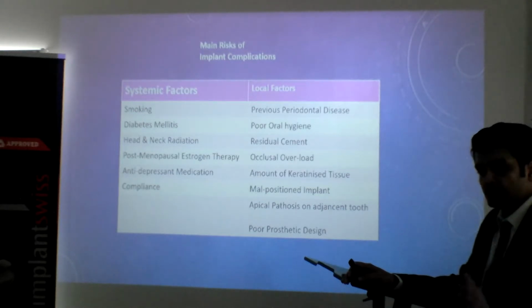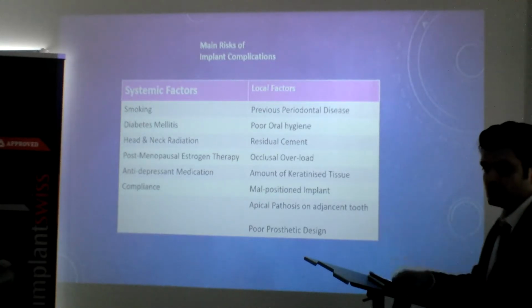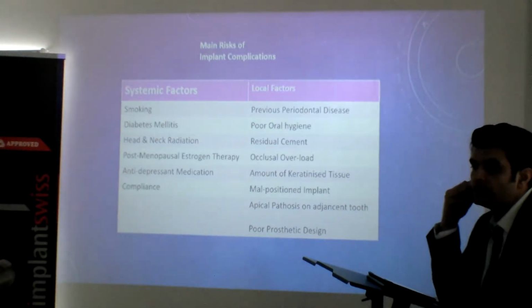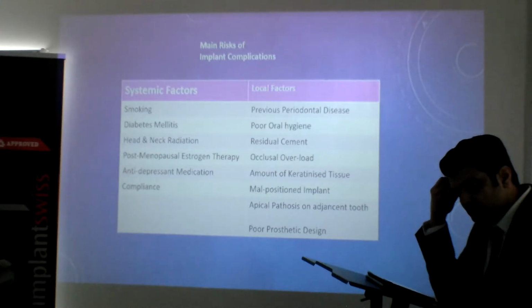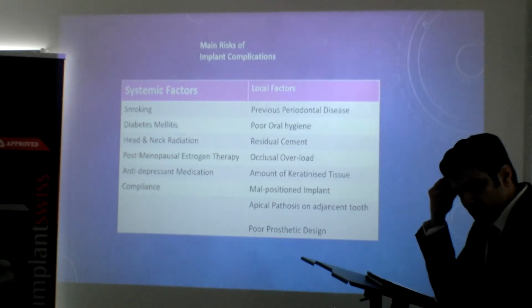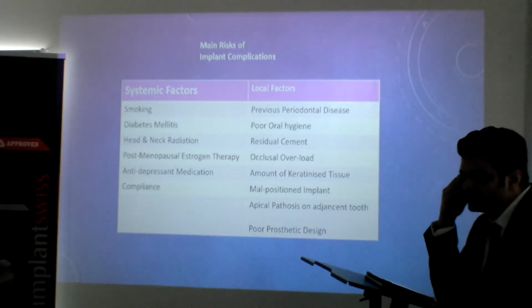So what are the basics, the 3 things that I just said? What are the 3 things that we're going to be doing when it comes to just photographs and taking the measurements? I'm using a probe. You need the space, how many millimeters? 2 and 2, so 2 on each side. So you're measuring the total ridge. The ridge is 6 mm. What are you going to do now? 6 minus 4, you've got 2 left. So what are you going to do now? Got more space, isn't it? Because the implant diameter has to be 2 or less then, isn't it? So you are a little fixed there. Smaller. How much is 2 mm?